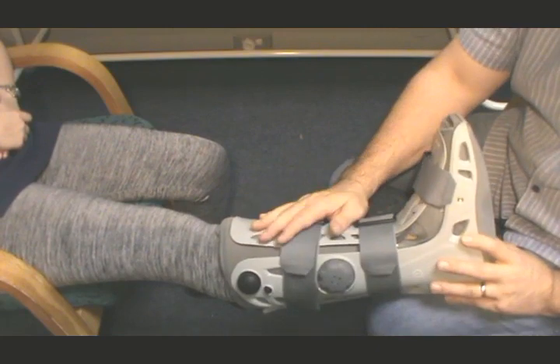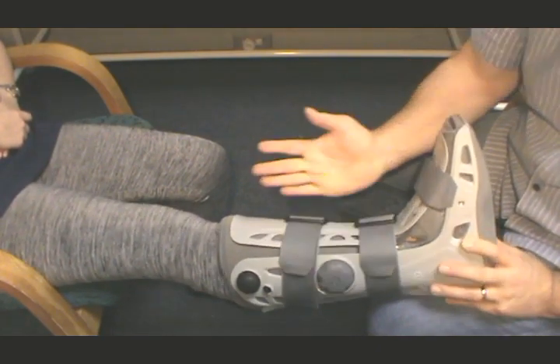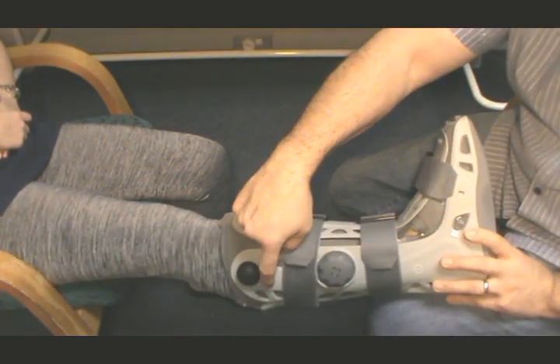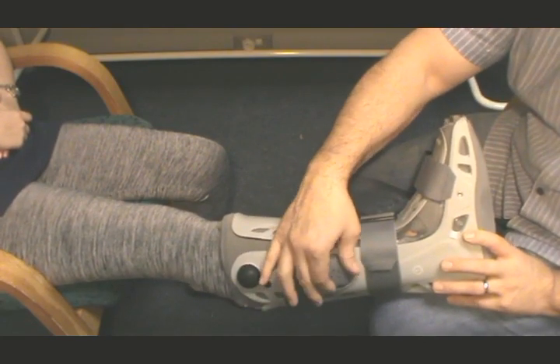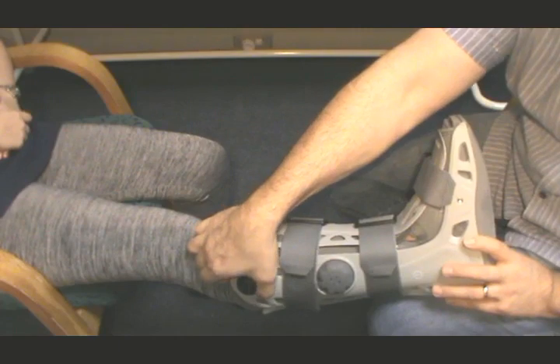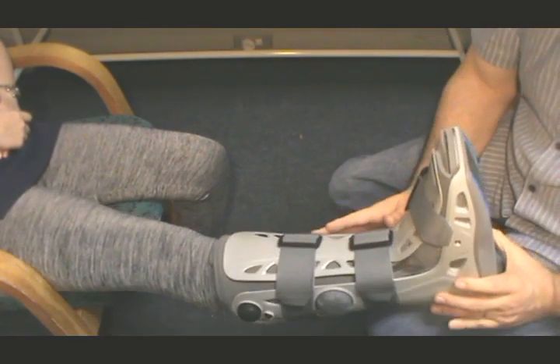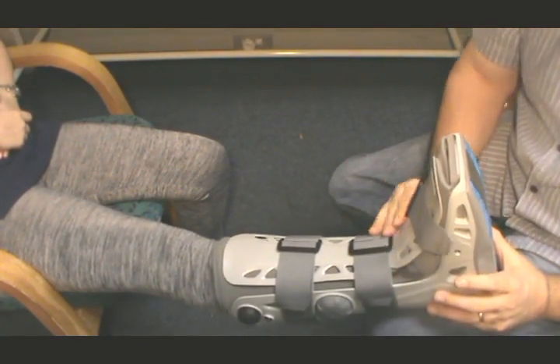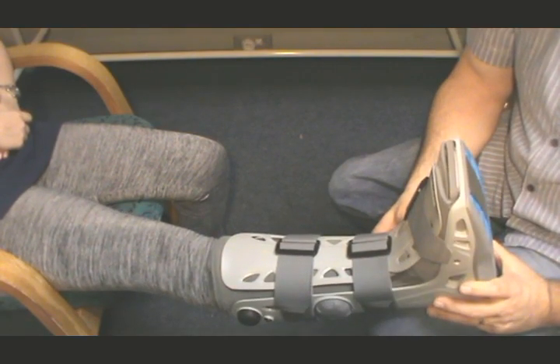To deflate the bags very easily, you've got it set on 2 there already, so we know that that is this side. So all we're going to do is just push the button, and we're going to release the air on that side, and then we're going to put it over to 1, and release the pressure on that one. And then once the pressure is released, you can remove the boot. Okay, so I think that's about tips and tricks for the boot.